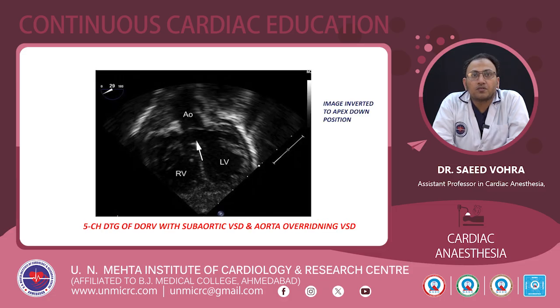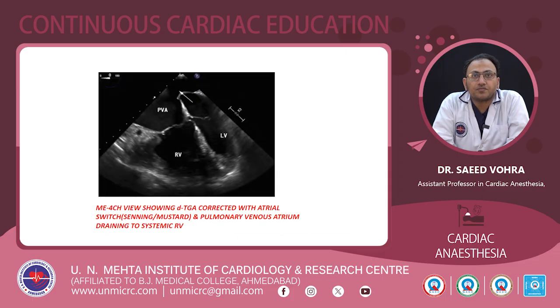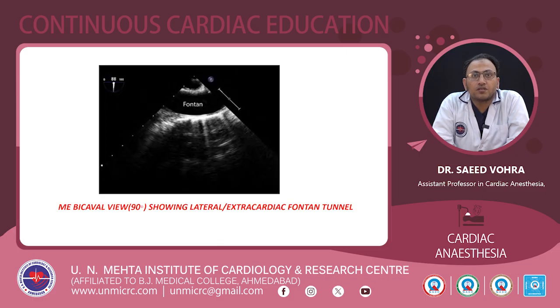This is a 5-chamber deep transgastric view of a DORV patient with subaortic VSD, and you can see the aorta overriding and getting blood from both LV and RV. This is a mid-esophageal 4-chamber view showing D-TGA corrected with atrial switch, and the pulmonary venous baffle can be seen draining into the systemic right ventricle. This is a Fontan patient, mid-esophageal bicaval view. You can see the Fontan tunnel.